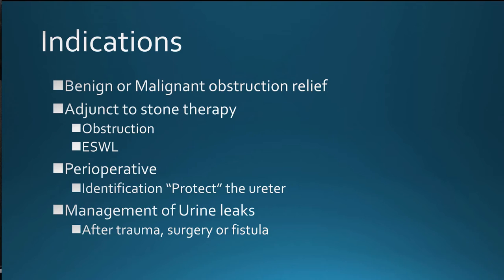Stent placement, preserving antegrade flow, typically results in healing of collecting system injuries. Stents can be placed in the setting of fistula formation, but usually this is palliative in the setting of malignant fistula formation to the ureter, as those typically are not going to heal spontaneously.